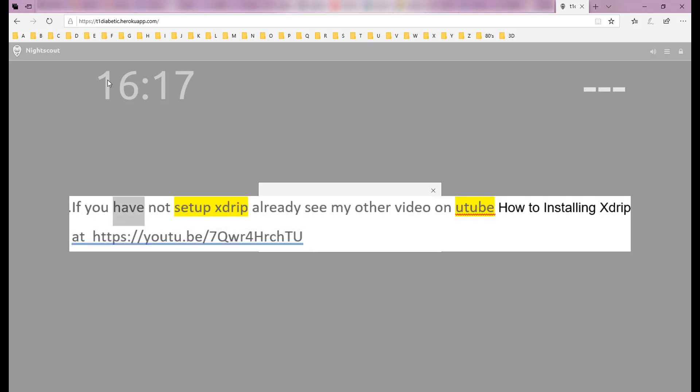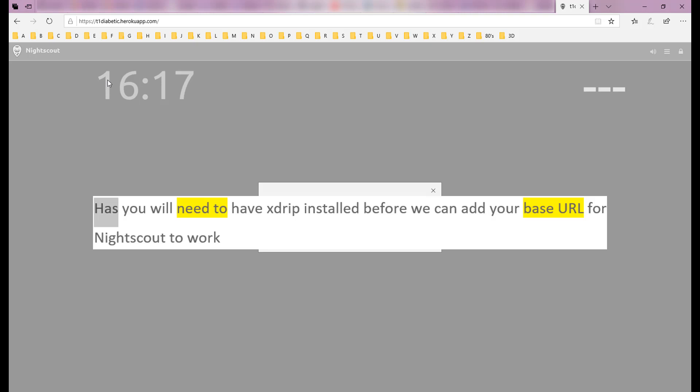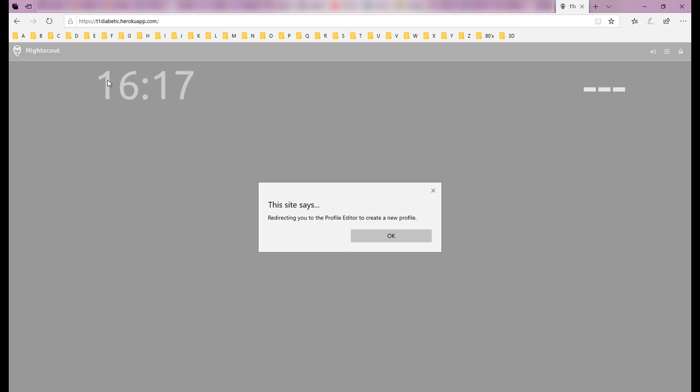If you have not set up xDrip already, see my other video on YouTube on how to install xDrip at https://youtu.be/7qwr4hrchtu. It is also on the Diabetic Way website. You will need to have xDrip installed before we can add your base URL for Nightscout to work.